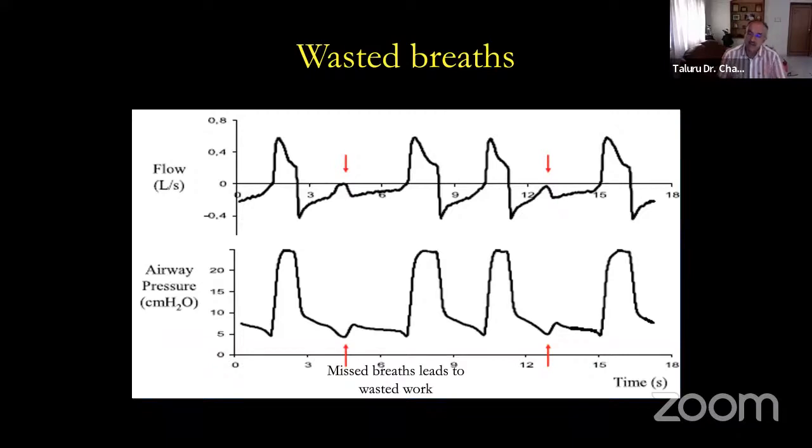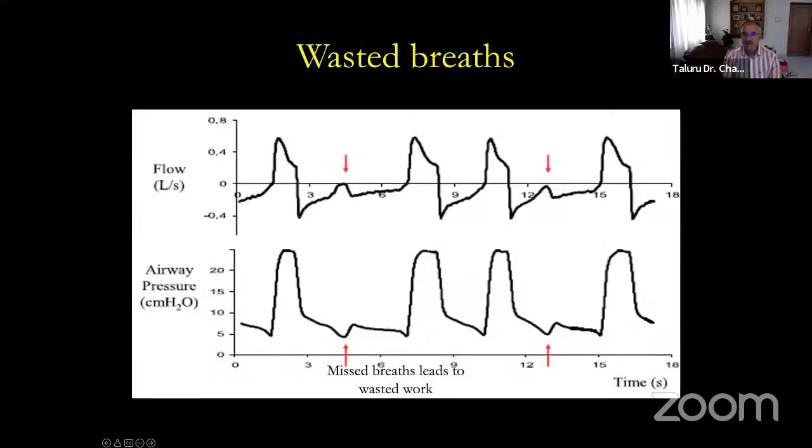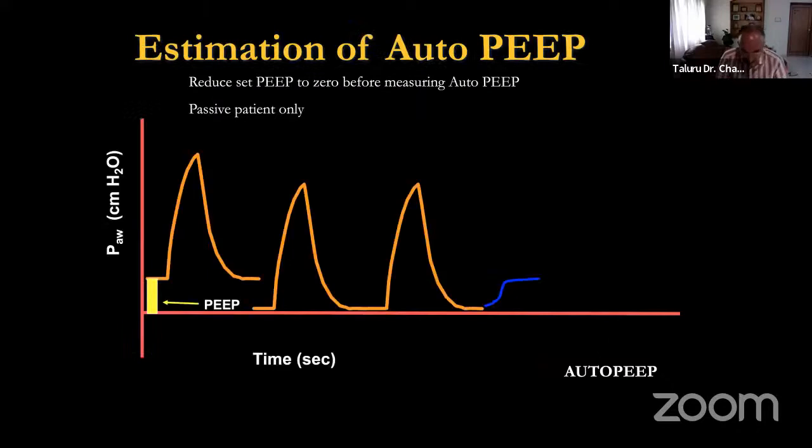You go back and look at your last session where I have given a screenshot of the pressure support where there is an expiratory trigger sensitivity. You can increase the trigger sensitivity from 25%. See, if you shift from 25% to 50%, the inspiration will get done here only. And if you have shortened the inspiratory time, probably you'll require to increase the rise time or increase the peak flows. Okay. So, estimation is very easy.